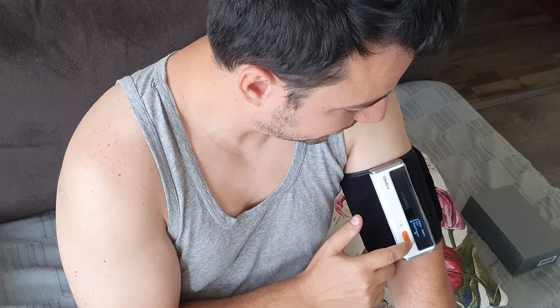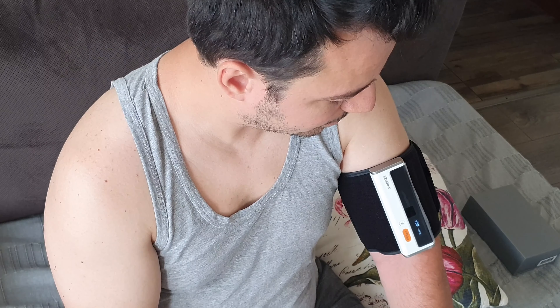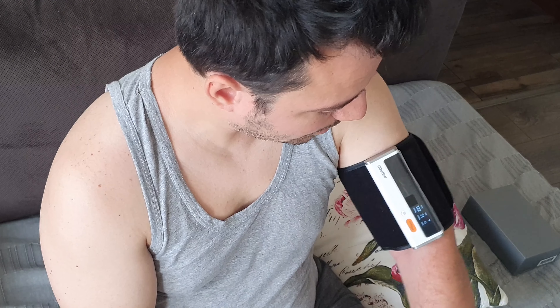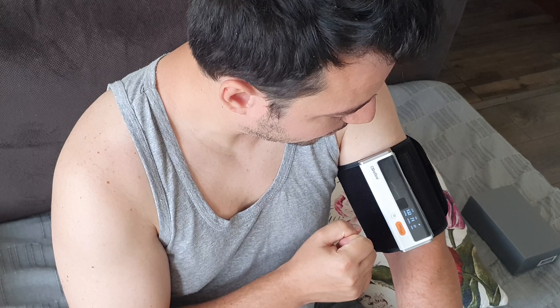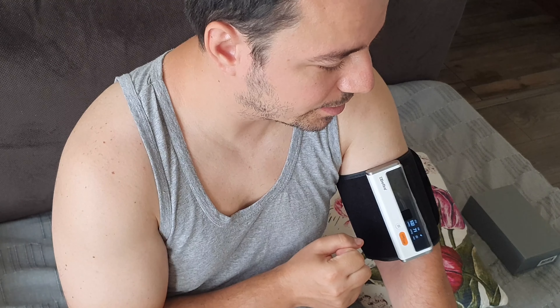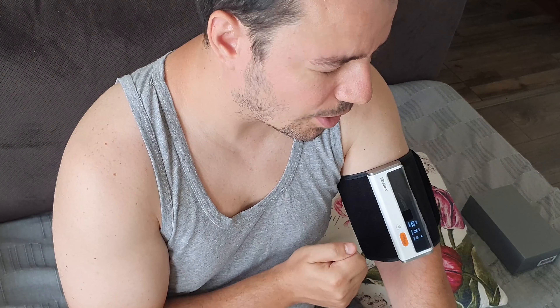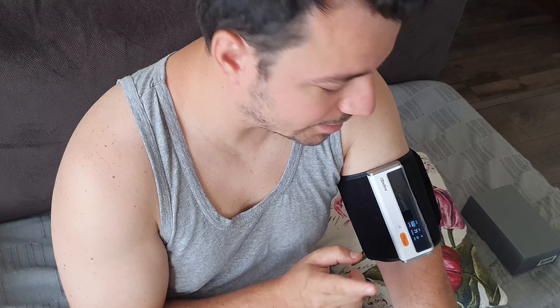Let's do a blood pressure test. We have 83 beats per minute. Also, this product comes with a two-year warranty based on your invoice, and you can purchase an extended warranty from them at a very low price for another five or seven years. They'll also grant you a discount code to get it even cheaper. You have to contact them via their site.